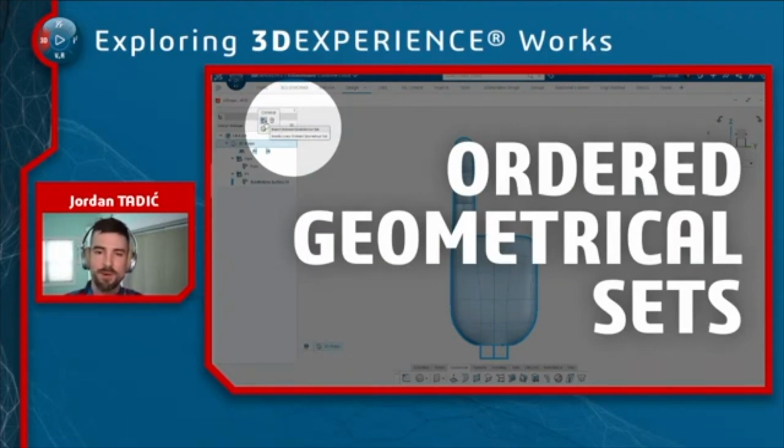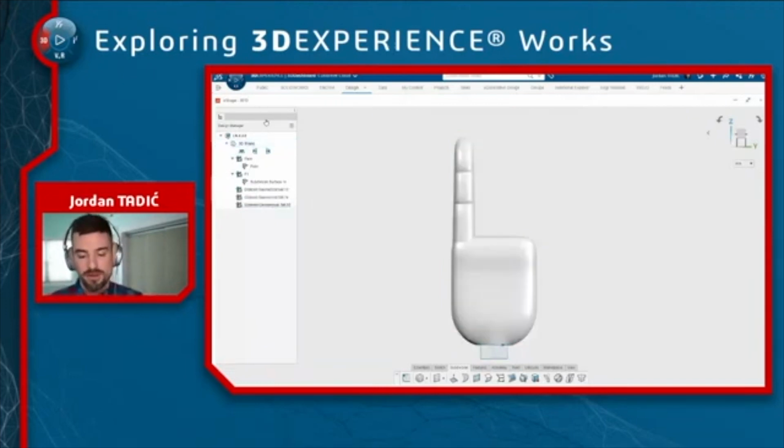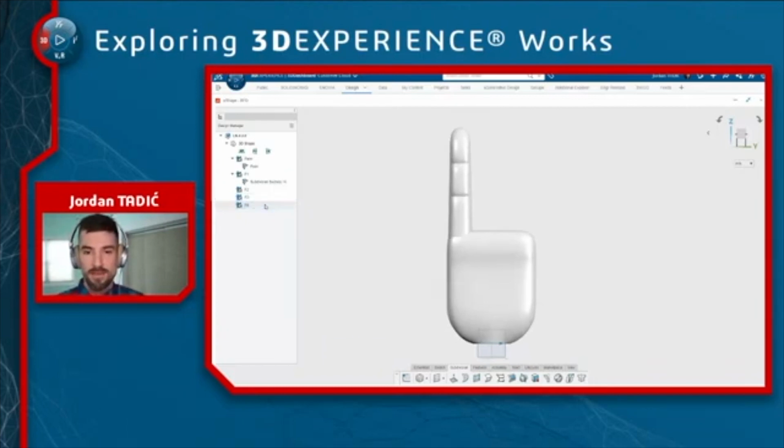So that is where I'm going to introduce ordered geometrical sets. It's a mouthful, but for anyone that's used SolidWorks before, it's also a mind-blowing enhancement. The opportunities of workflows that you can accomplish with these ordered geometrical sets can get really, really creative and very, very cool. So for now, just think of it as a folder. I'm using it in its most simplistic workflow. And I'm creating multiple folders, because I'm going to create a folder for each finger. That way I could keep each subdivisional surface of that finger separated into those folders just for organization purposes.